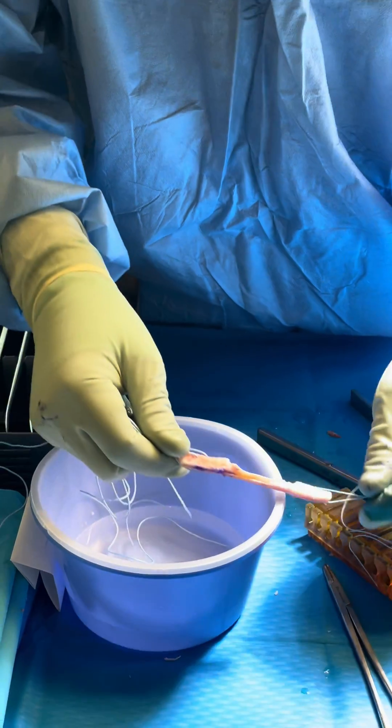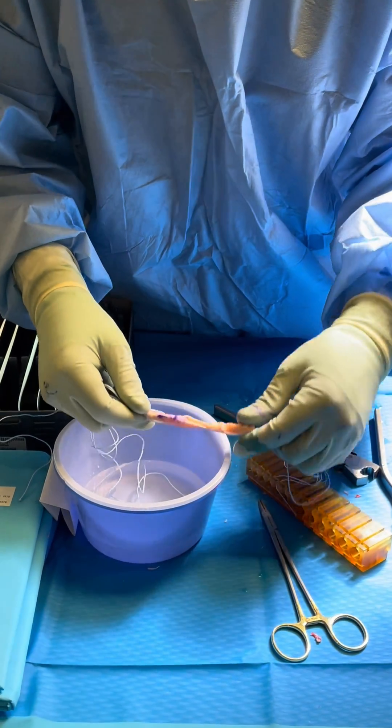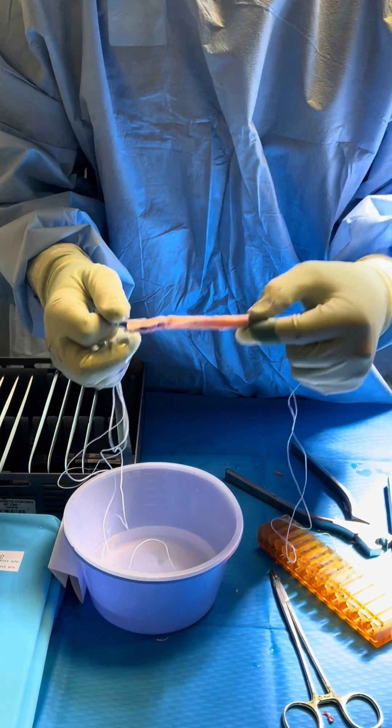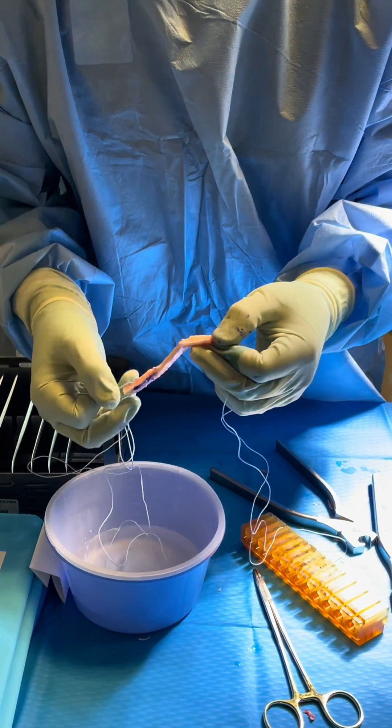BTB is bone tendon bone. This is off the tibia and this is off the patella, and this is just about the central third of the patient's patella tendon, and that's going to be used to reconstruct their ACL. A couple of things here.